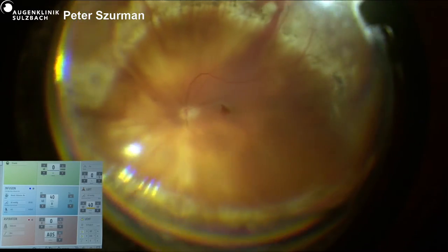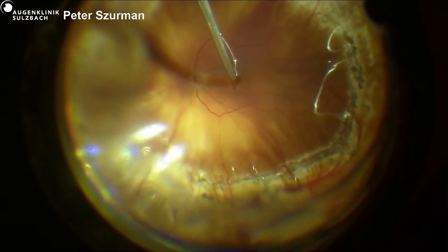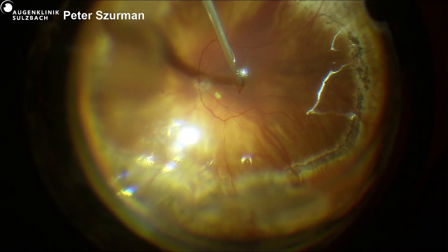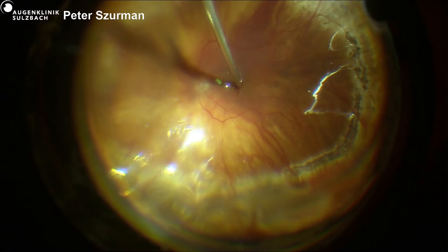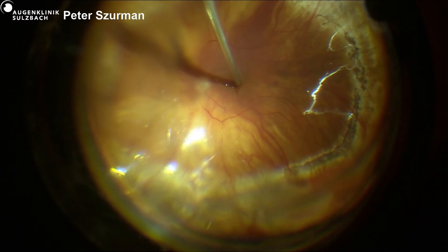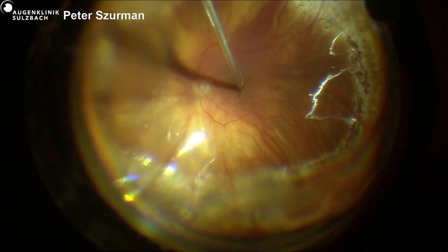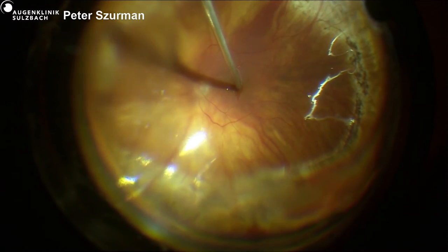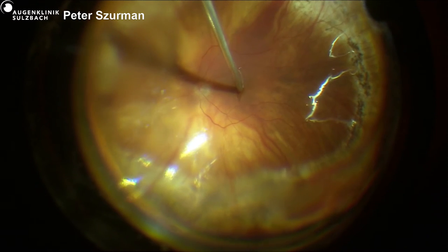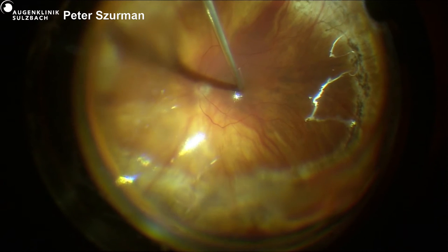So it's quite a large macular hole. It's like a trauma situation. I've rarely seen such a situation. That's why we have selected the case for today. We are all thinking that it's probably related to some kind of trauma or surgical misadventure, something that happened during the first surgery. Yes, but if we don't close it, the visual acuity will be gone. So we need to bridge it, at least to help bridging with something. And this is my hope, that we will either find PVR membranes and we can relieve the traction, or the amniotic membrane helps to bridge this defect.